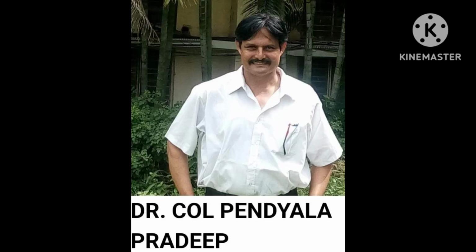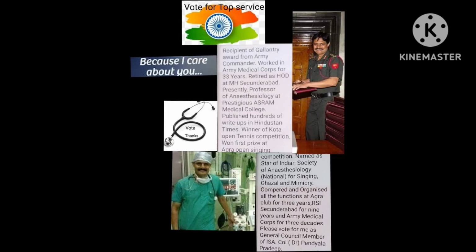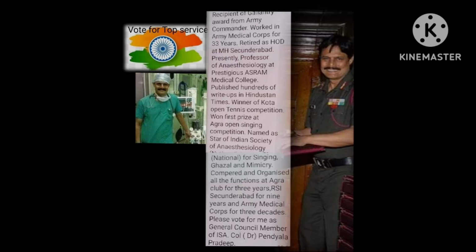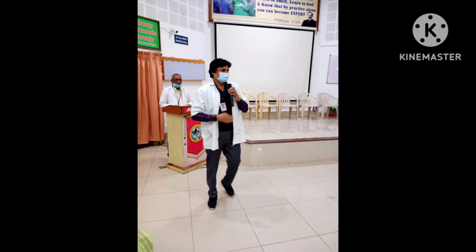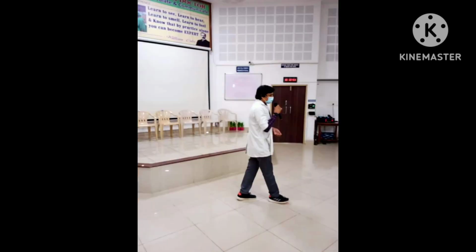Helium produces a faster balloon response, which is the reason helium is usually used, but the physiological significance has not been exactly understood or defined. Does it increase cardiac output? While balloon counterpulsation augments aortic pressure, this increase may not improve cardiac output or decrease pulmonary capillary wedge pressure. That you should know.